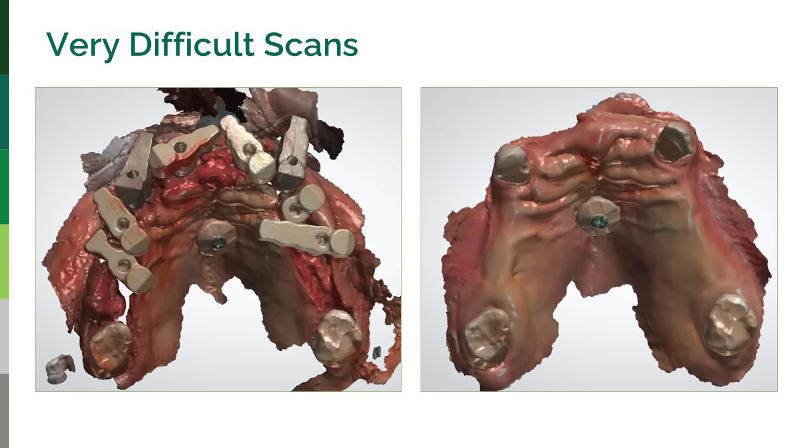And just look at the fiducials, right? There's 2 remaining teeth. There's a fiducial marker in the palate, stable, predictable, but the scan itself. Imagine capturing all of this and then registering it back to the one on the right hand side. So many variables. Predictability is not certain here.